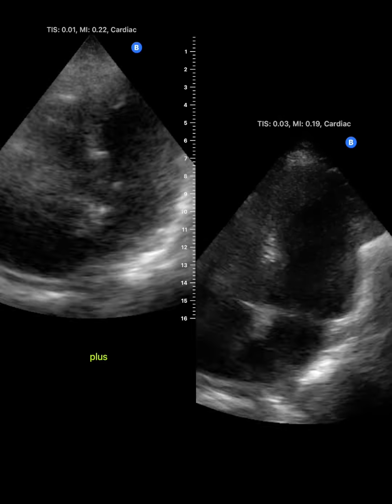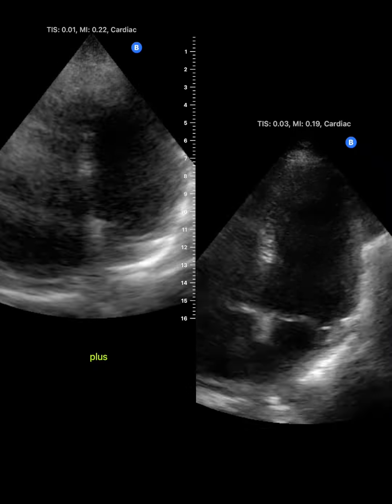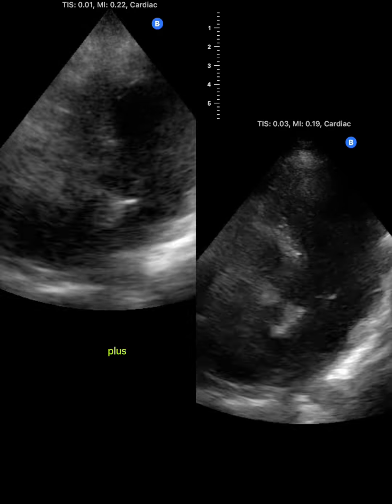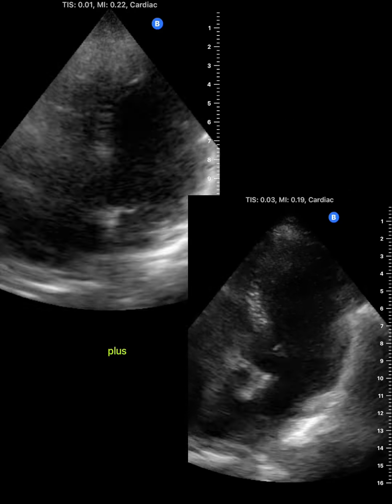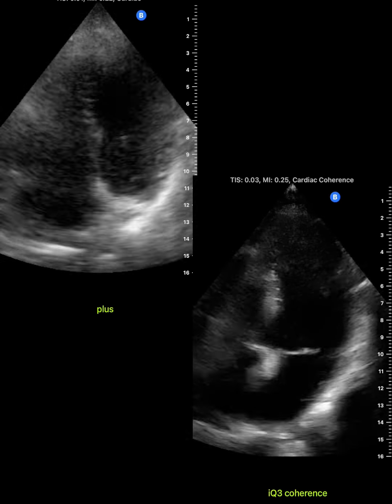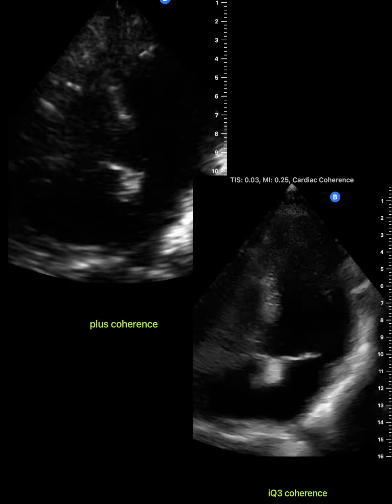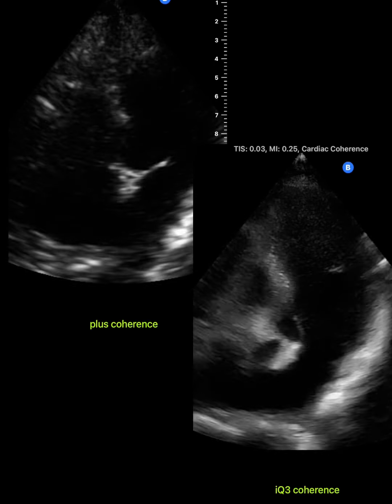Let's look at them side by side. Here's the old IQ Plus on the left and the new IQ3 on the right — same patient, same day, same scanner. And here's that coherence mode with the big improvement in clarity and resolution in the IQ3 on the right.